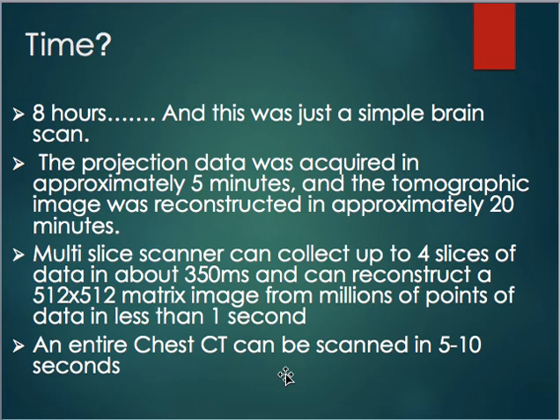So in the early days, CT was not meant for trauma or fast situations. It took a very long time. And the problem with that was that patients needed to lie still for those images. Anytime a patient moves during a CT scan, it can cause blurring. So imagine trying to lay still as a patient for 8 hours, depending on the scan. This was very early on, but doctors were still amazed at what they could see.